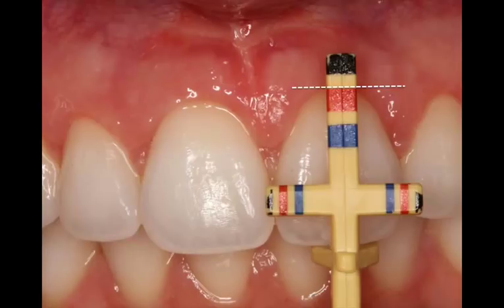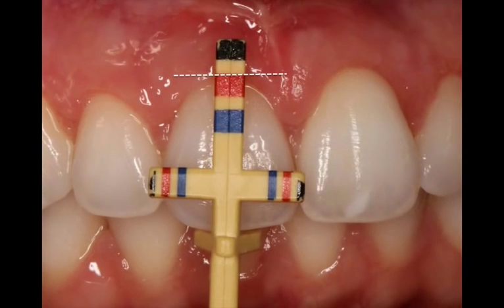Now, I went back with my proportion gauge, and I wanted to see how I did, and I'm looking at number 9. The width of the tooth is in between those two red lines, and the height of the tooth is all the way to the red line. So we have proper tooth proportion. And how about number 8?